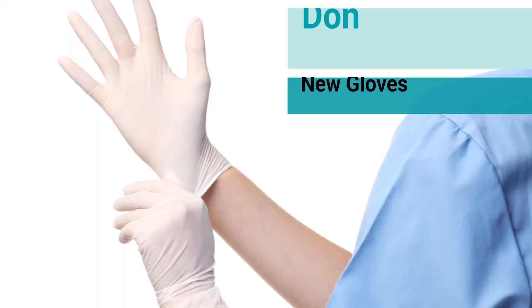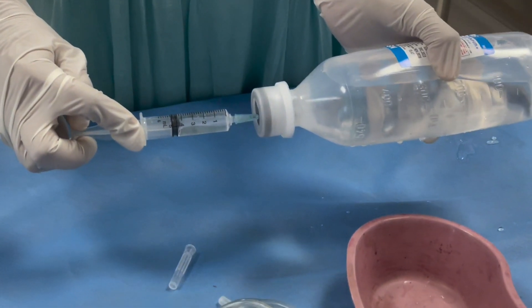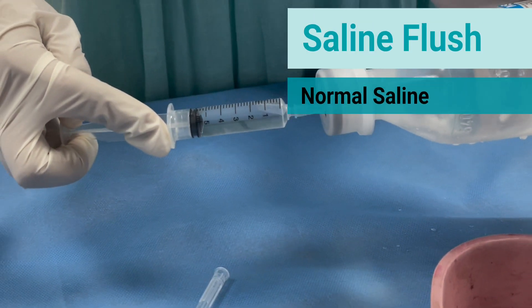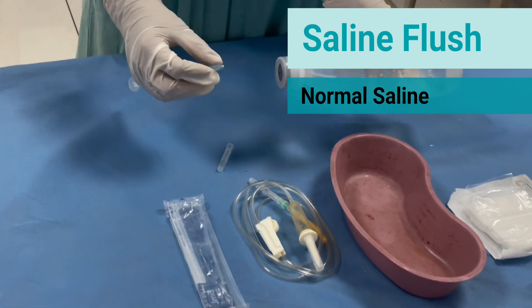Don a fresh pair of gloves. Prepare a saline flush using a syringe and normal saline. Keep it ready.